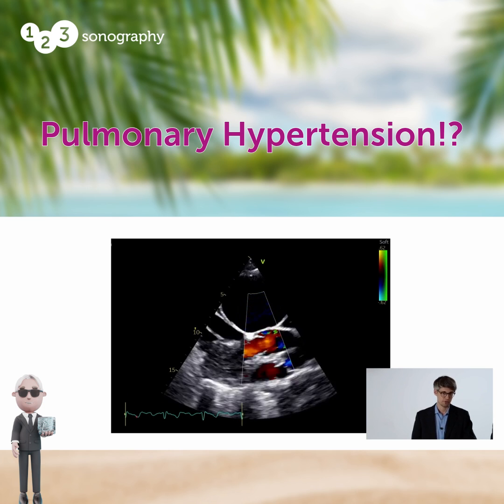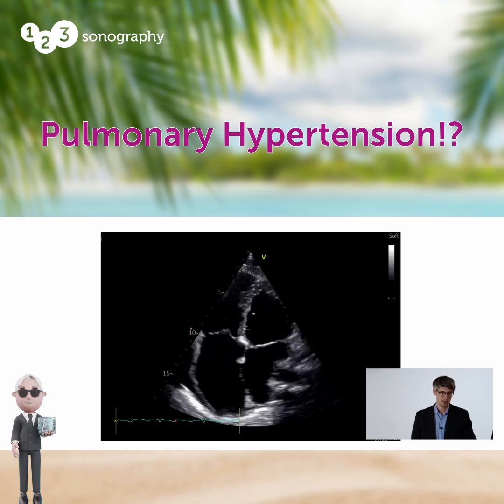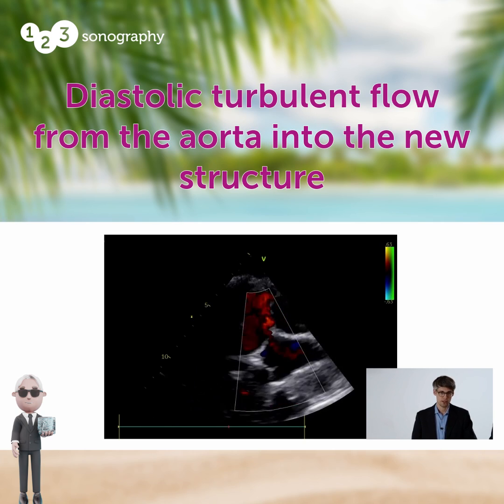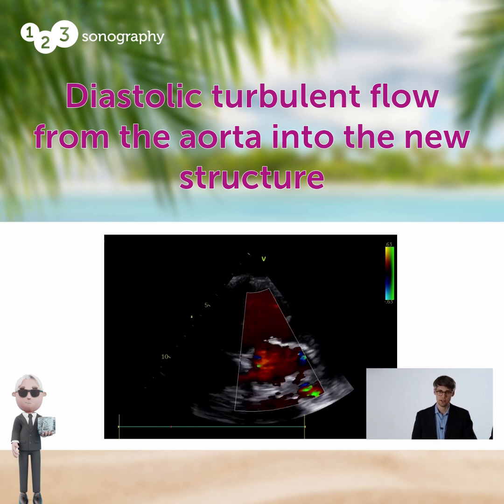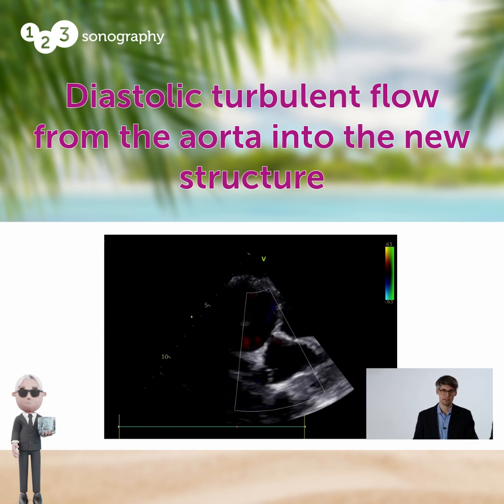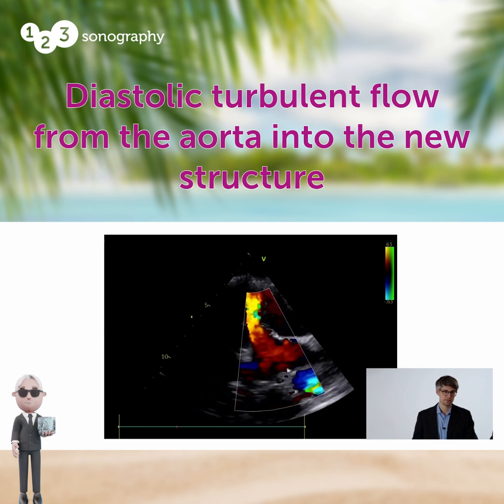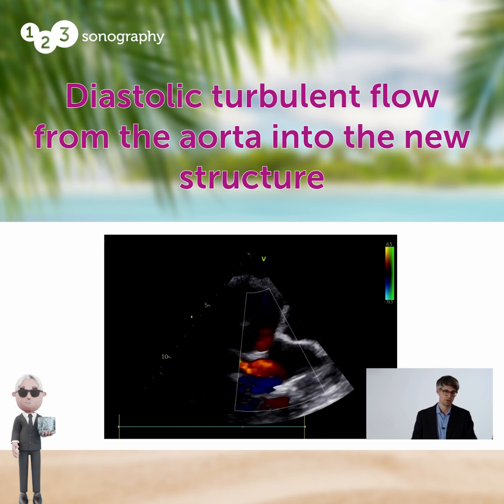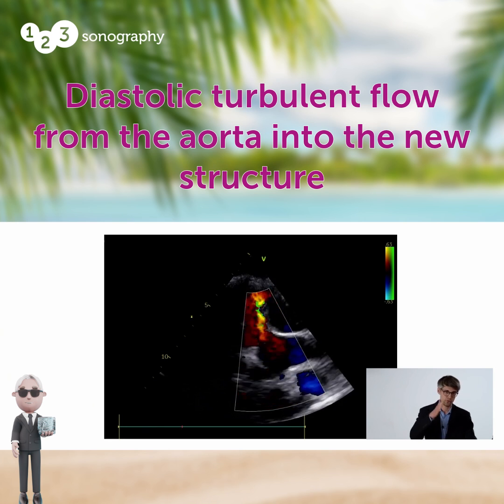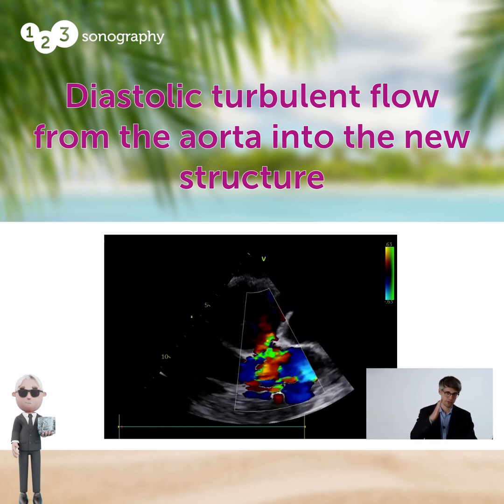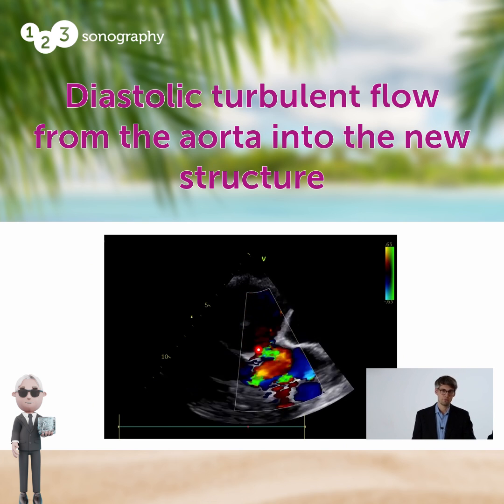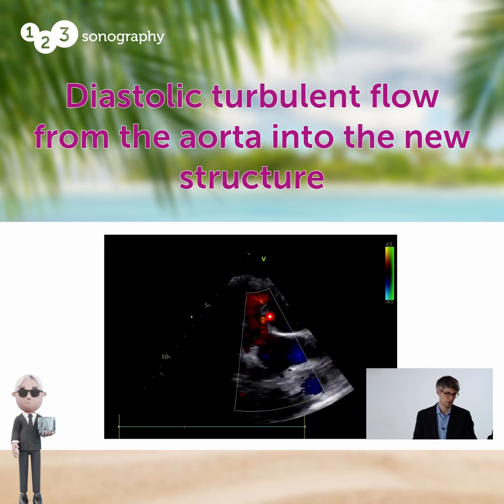Here's a color Doppler flow — the left heart doesn't really seem to have any problem. However, in the apical four-chamber view, the right heart is dilated. Looking at the long-axis view and moving the transducer up into the ascending aorta, you can see only a diastolic color Doppler flow going from the aorta distal to the aortic valve and going up into this dilated, large, round structure.